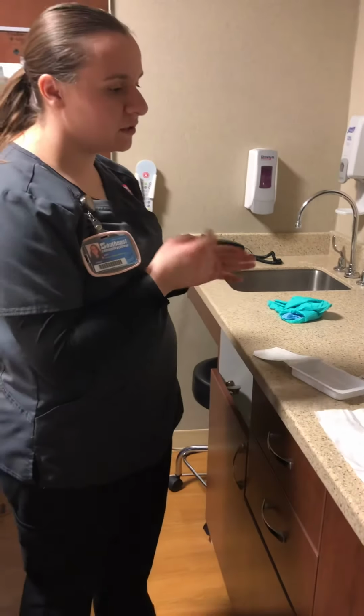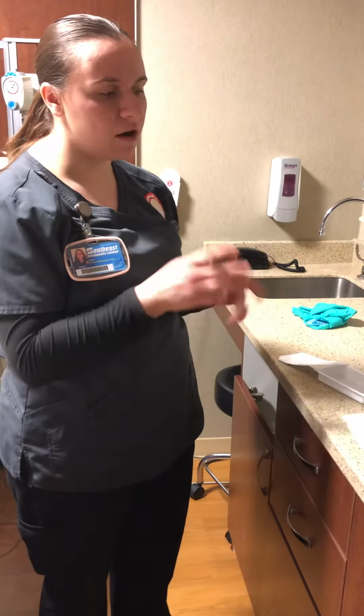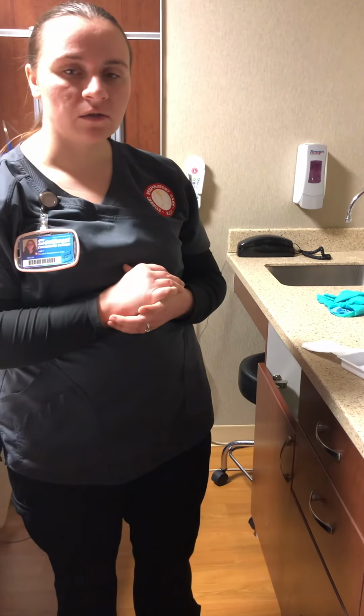Clean off the tables, anything that I have touched, anything that may have got anything on it, always clean it off. I would always go and then chart on the patient's chart, and then I would let anybody of the staff know that I did a nasotracheal suctioning.